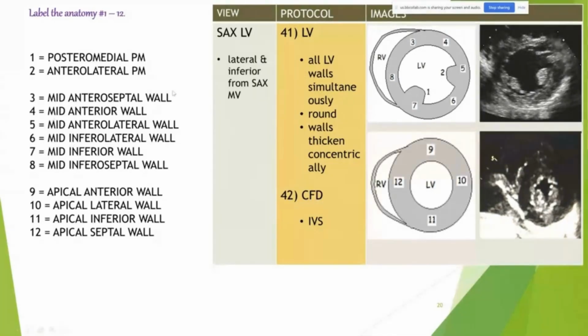You know what? The mid comes from when you are on the probe. This is the middle wall. You're not at the apex anymore. We were at the base before. Like when we were talking about the aorta and stuff, we were at the base. So instead of mid, that would have changed to base. See what I'm saying? Like, for example, this is the apical, this is the mid.